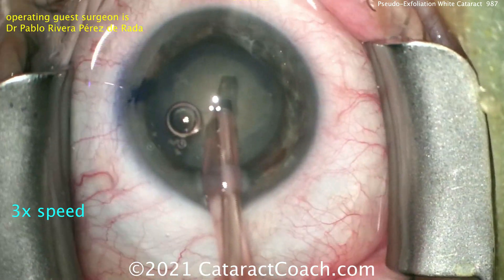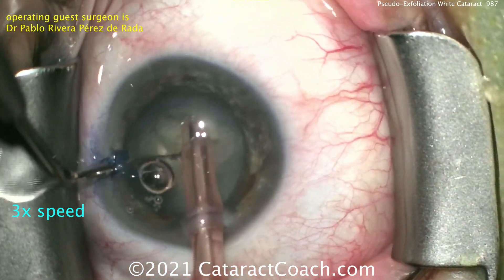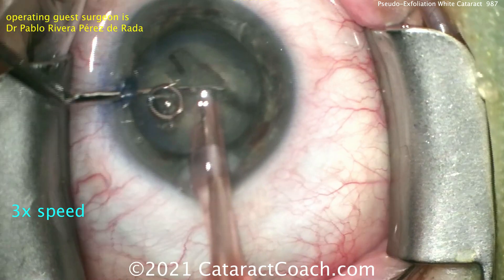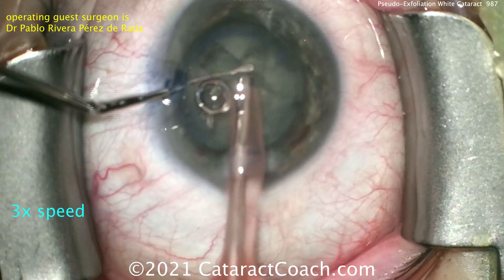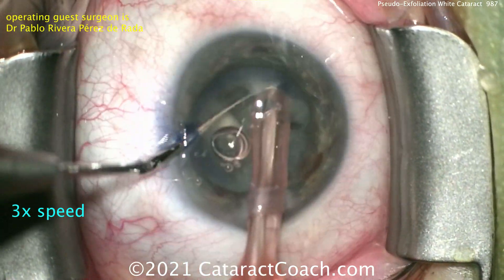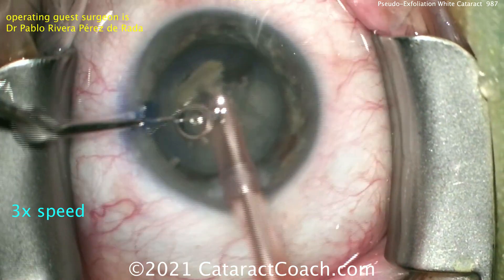Now you can also extend these grooves that are being sculpted, or you can just leave it as is, get the instruments deep in the groove like that, and create the split. And now that the split has been achieved, grooving can be continued for the heminuclear pieces in order to create quadrants.